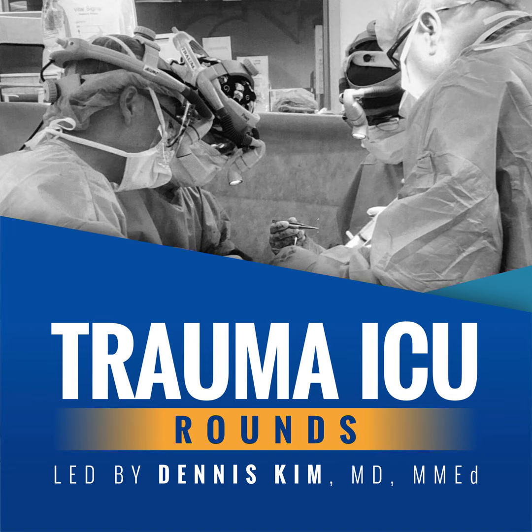Unlike a T-piece SBT, where patients are completely disconnected from the vent, during what's known as a pressure support SBT, a set PEEP and target pressure, usually around 8 to 10 centimeters of water, are set by the clinician. The patient triggers the breath and the vent delivers the set pressure above the baseline pressure, in this case the PEEP, which is usually around 5 centimeters of water, to assist the patient's breathing effort. More on this in a bit.